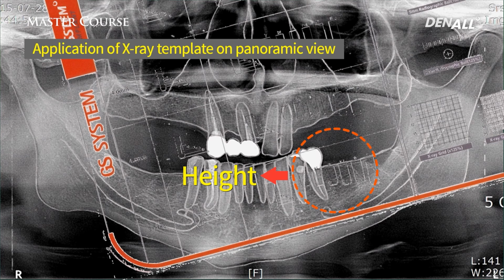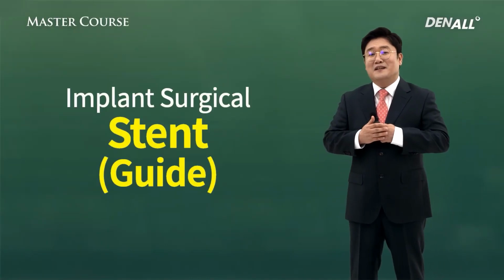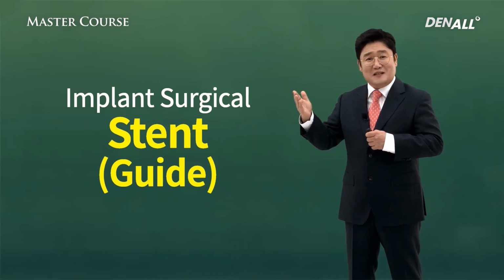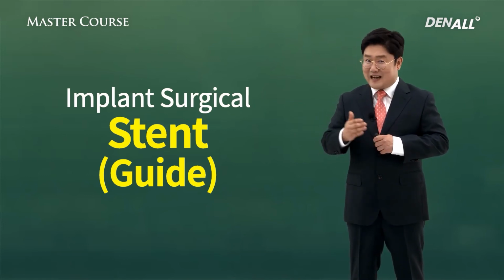Implant fixtures need to be selected, fitting that height of bone. Anatomical structures need to be avoided when we choose the implant fixtures. Maxillary sinuses or inferior alveolar canals need to be avoided when we choose the implant fixtures. Another thing, in the past, panorama was very actively used because it was used for the implant surgical stent. The stent is sometimes called a guide.